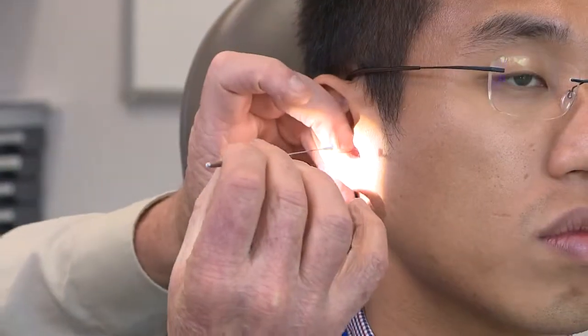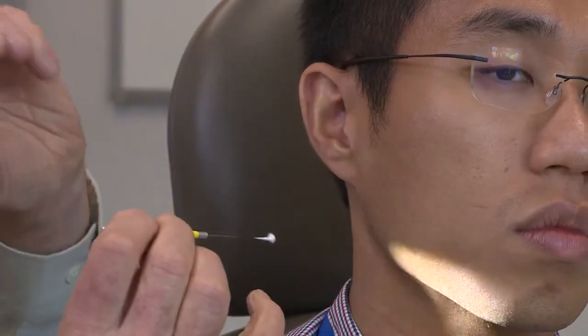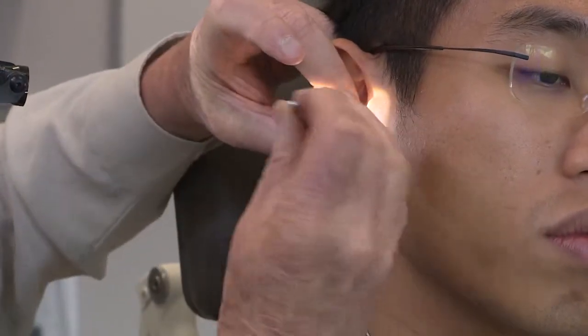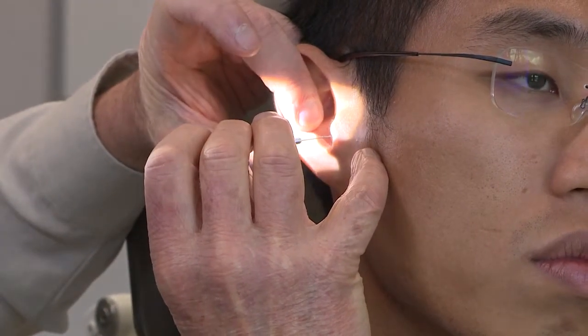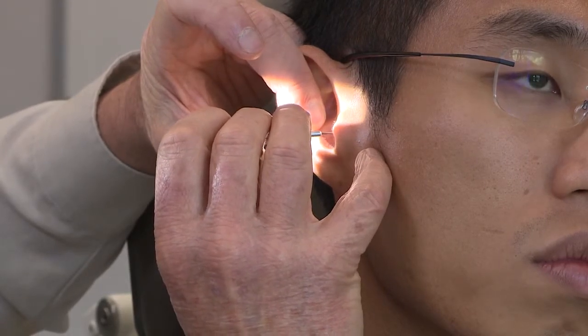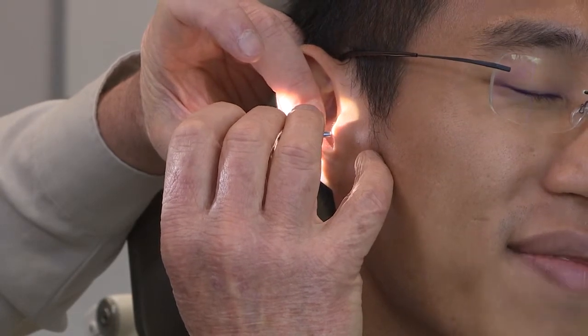You could do it with or without a speculum. I've got somebody who is probably happy if I touch his eardrum, so let's just do that just to show. Now that's halfway — I can see where the hairs have stopped and the pink skin started, and it will be touching the wall with the cotton wool, which he will be feeling. He'll tell me when it touches his eardrum. That's bouncing on his eardrum — I could see it moving.